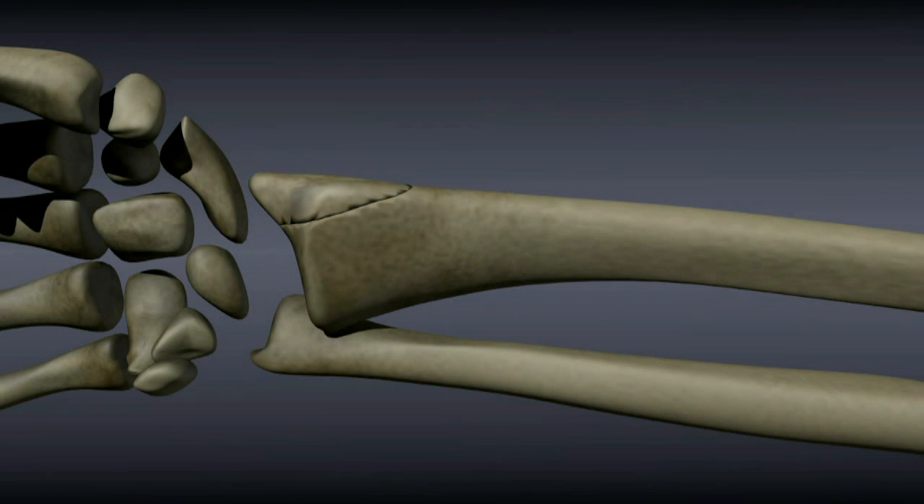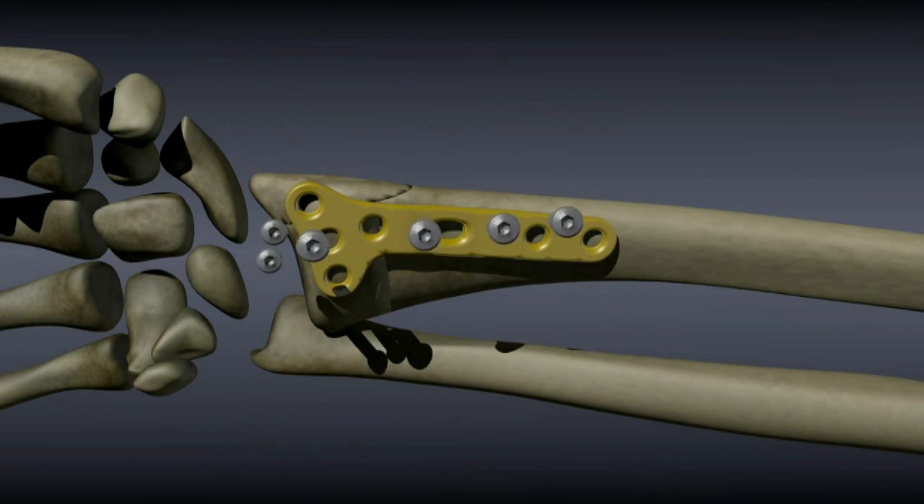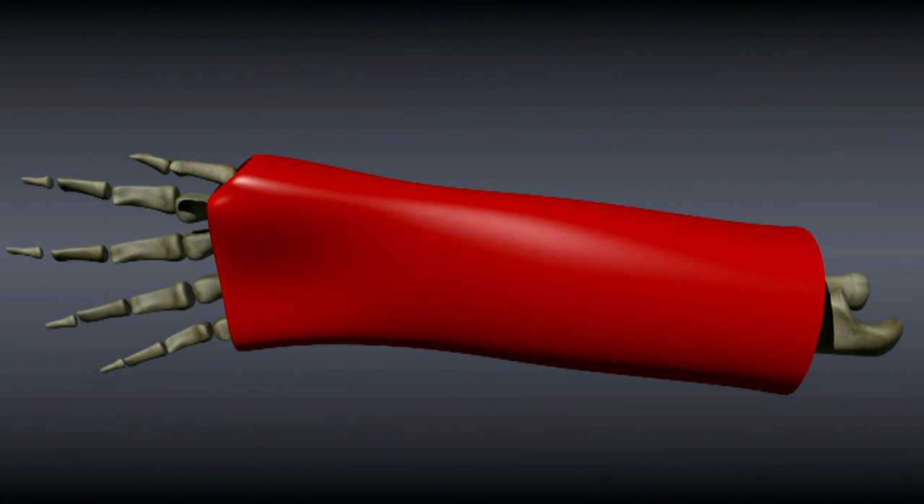Sometimes screws are used rather than pins. A plate and screws are necessary for more complex, unstable fractures. After surgery, the wrist is placed in a cast.